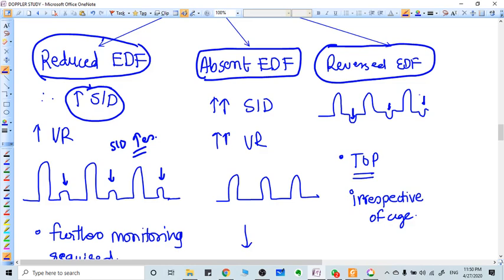In the diastolic period of the fetal heart, the placenta actually throws the blood back towards the fetus, as it doesn't want more blood. So the placenta is very highly resistant in these cases, and this case should be terminated as soon as possible. Otherwise, in 1 or 2 days, the fetus will die. So this is a very grave condition.